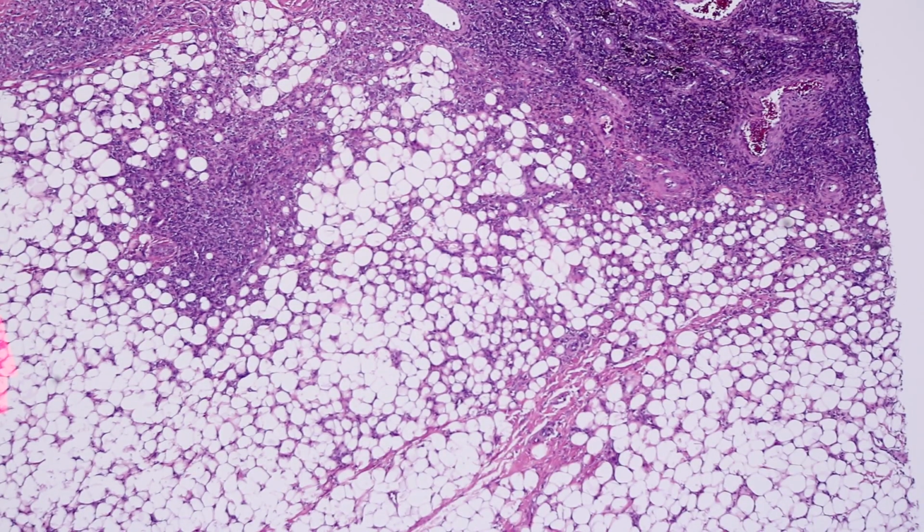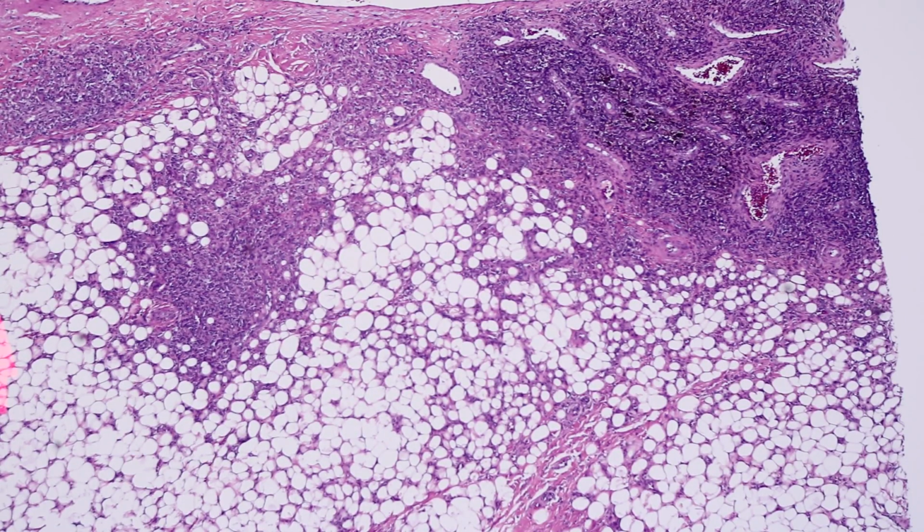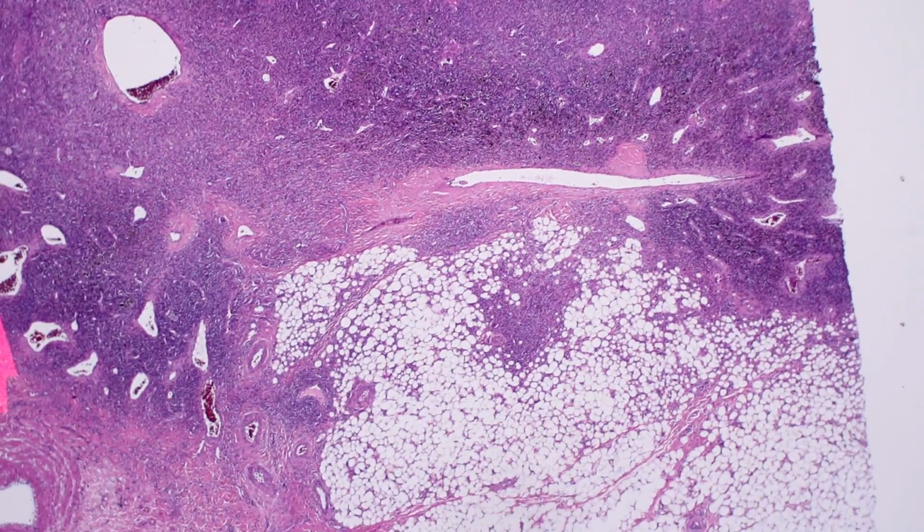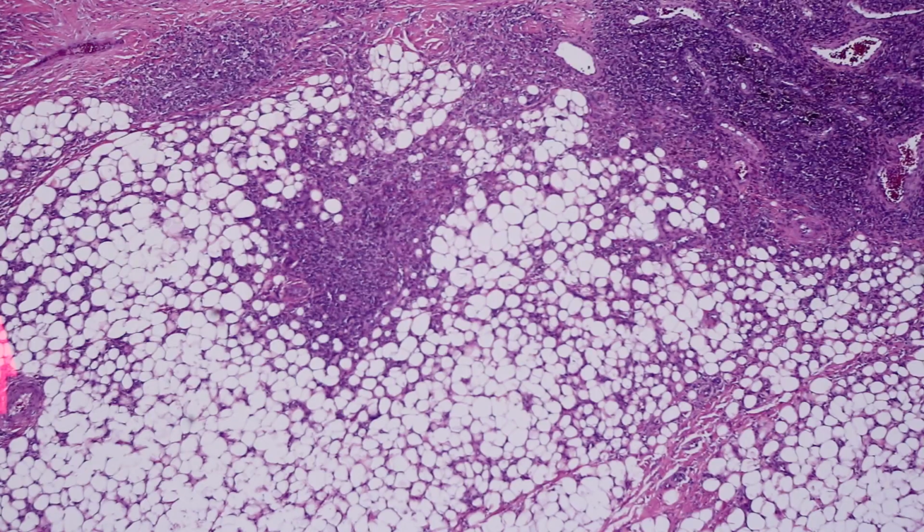So here, this kind of trickling into the fat, sending little tendrils or little feet of tumor down into the fat, that's the usual pattern of fat involvement in a dermatofibroma. Dermatofibromas often splay into the dermis and send little fingers into the dermis at the edges peripherally, and when they're large enough and go down to the subcutis, at the deep aspect, they often send little fingers down into the subcutis, just like we're seeing here. And again, look at how huge this tumor is. It's not surprising that it spreads down into the subcutis a little bit, okay? But that's the usual pattern that you see there.